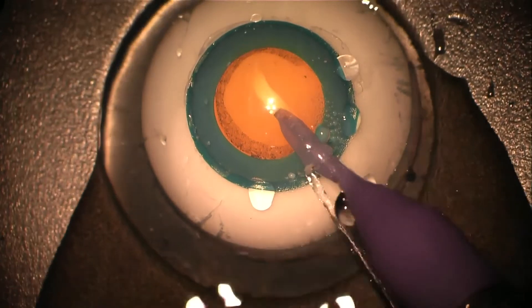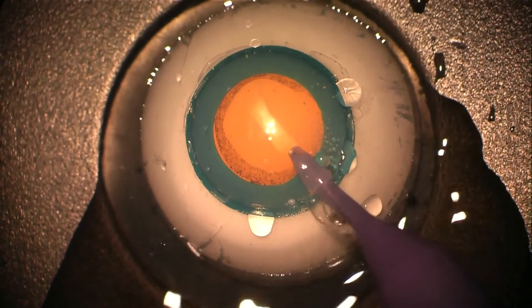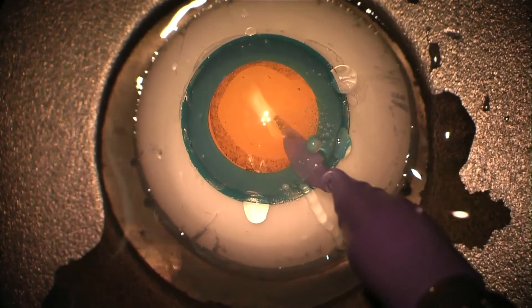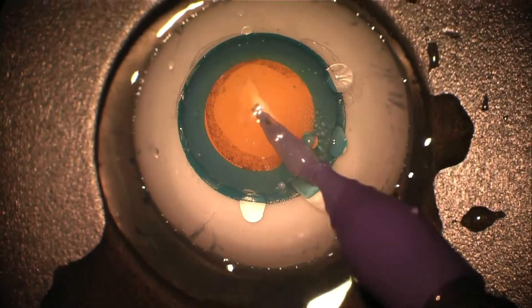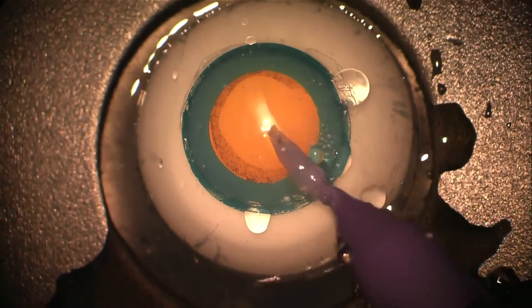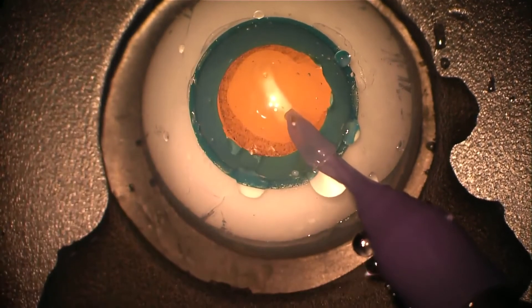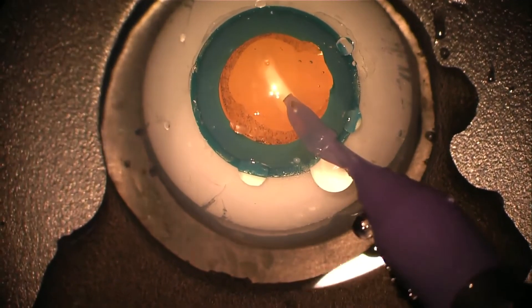rather than pushing through the lens and keeping the probe depth of the groove at about one and a half probe widths. Just using my finger there to clear the view.